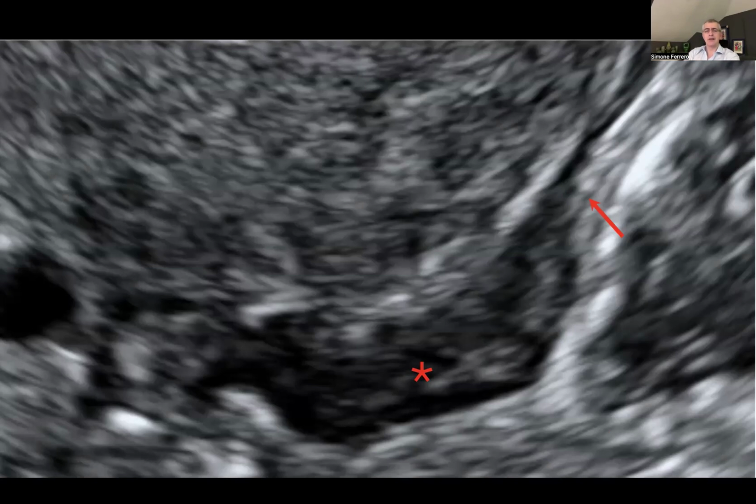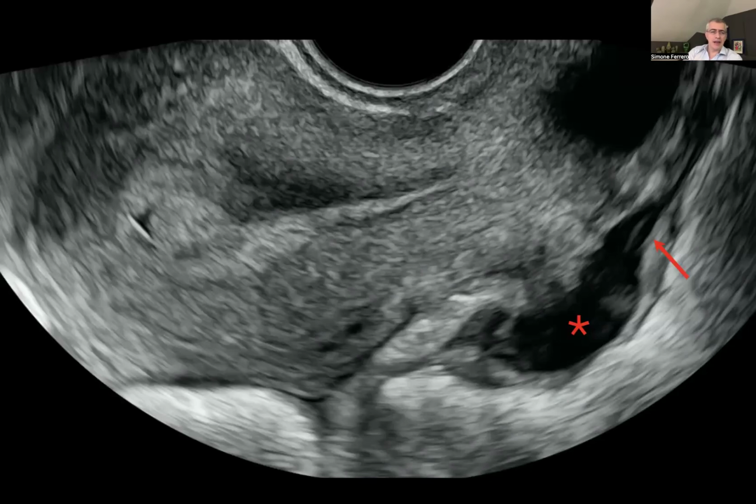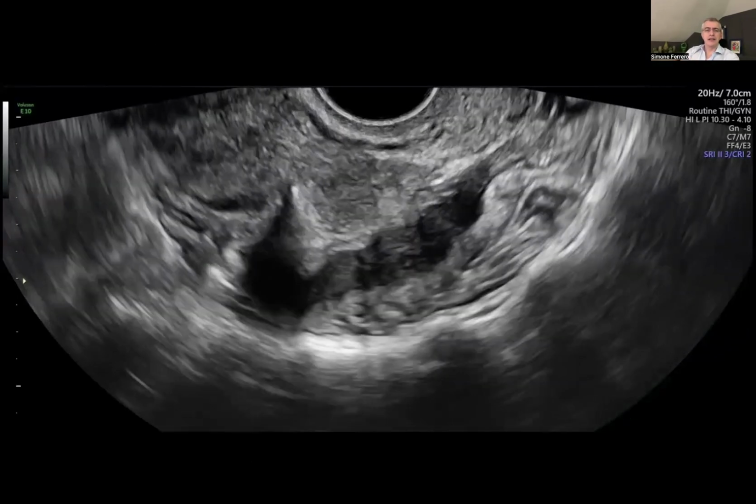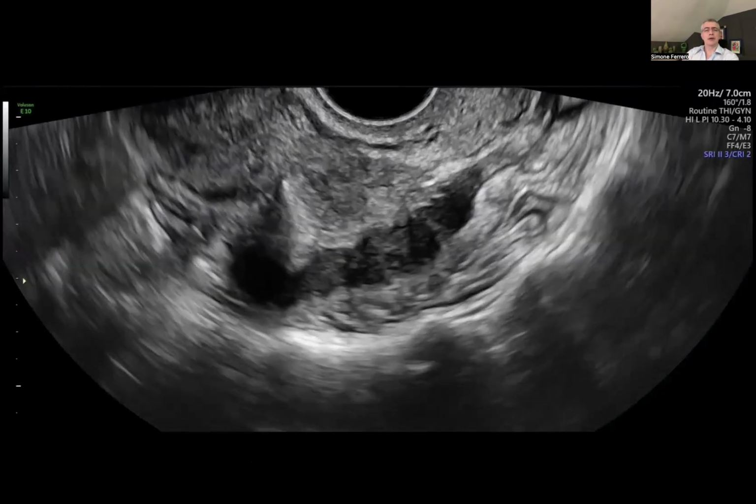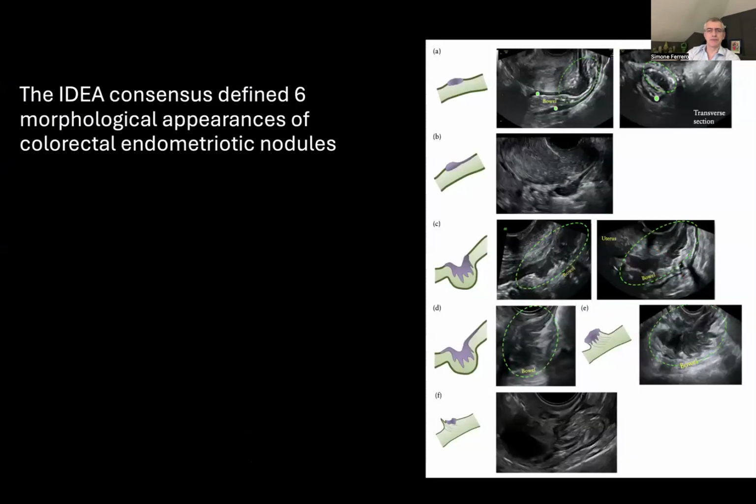you can see that there is a progressive narrowing of the nodule that is indicated by the arrow, that is the so-called comet sign. And again, in this picture, you can see another nodule which has the progressive narrowing that is named comet sign. Here you can see an extensive nodule. The largest diameter of this nodule is approximately 5 centimeters, which infiltrates the intestinal muscularis propria.